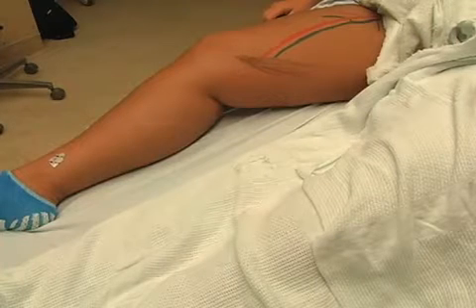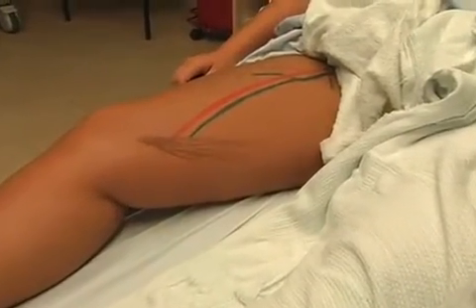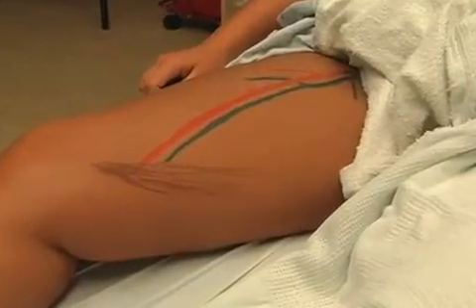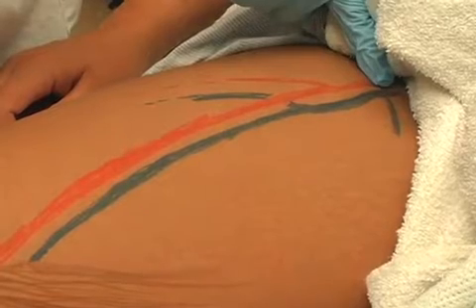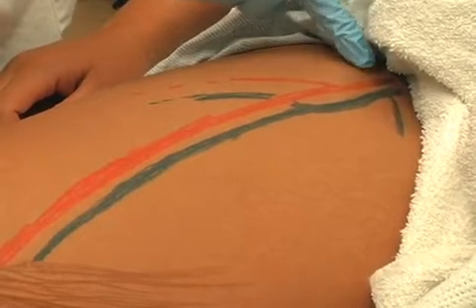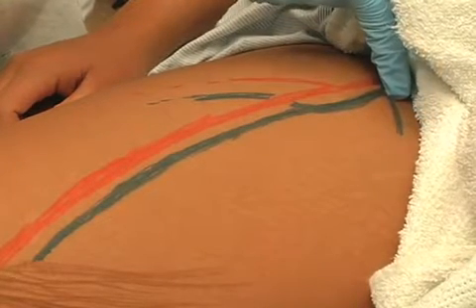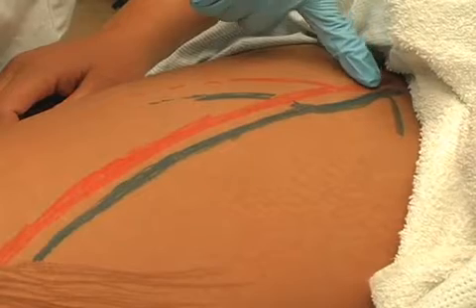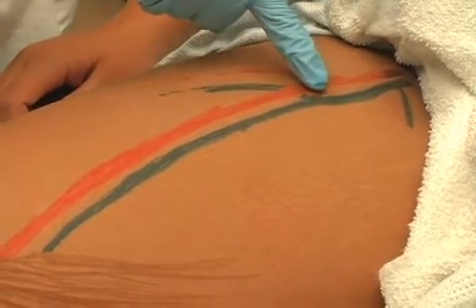While there are many venous structures in the leg, national guidelines direct imaging for DVT to the main deep venous structures of the proximal leg. Beginning at the inguinal ligament, the common femoral vein runs distally adjacent to the femoral artery. The saphenous vein is seen as a contributory vessel from the medial proximal region. The common femoral vein quickly bifurcates into the deep and superficial femoral veins.